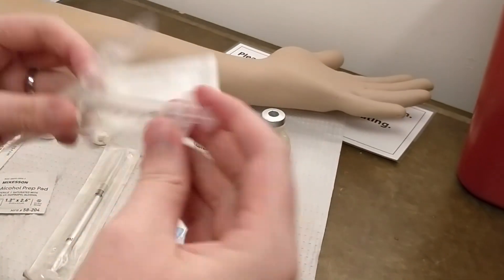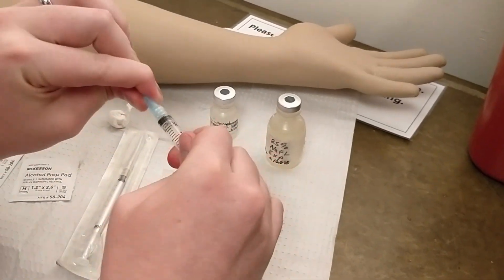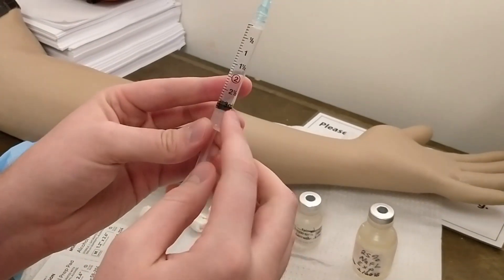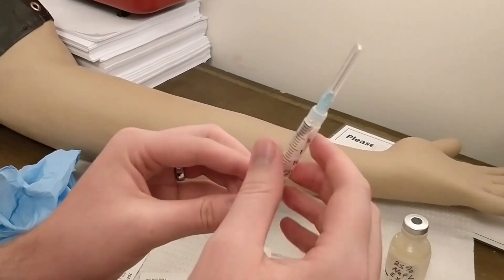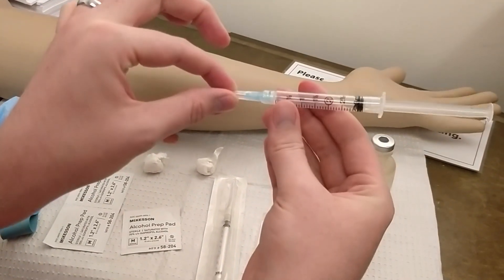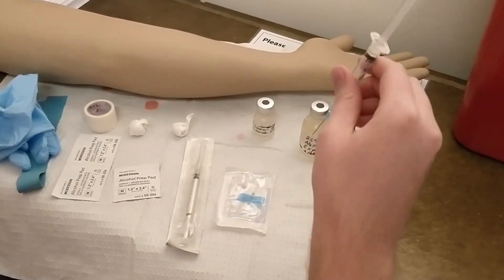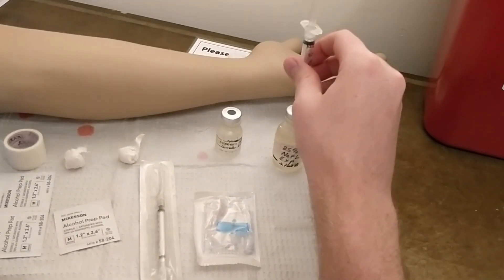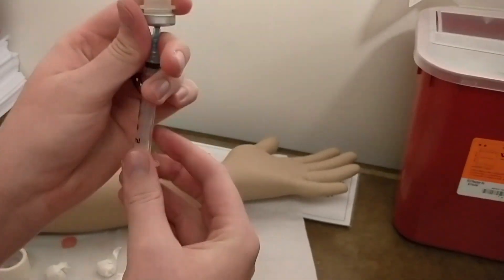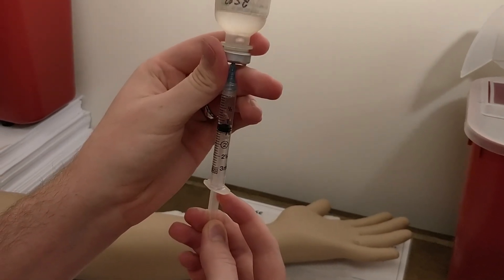Now we can prep our syringe. Get the syringe out of the casing — you can throw away the packaging so as not to clutter your aseptic field. Same with the needle — twist it on firmly and make sure it is all the way on. Now aspirate air — we would aspirate more than the three milliliters we are going to pull up, but with this syringe three is the maximum. Remove the cap by pulling far apart, not just a little — that is a good way to get yourself stabbed and lose points. Pull firmly apart, setting the cap down so it is not pointing towards the patient or yourself. Using one-handed technique with one hand behind your back, insert the needle into the vial, aspirate all the air back in, and invert. Once inverted, slowly pull back the medication — the slower you do it, the less air you will get.